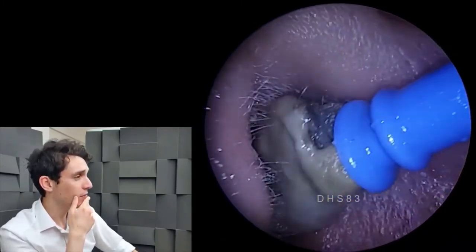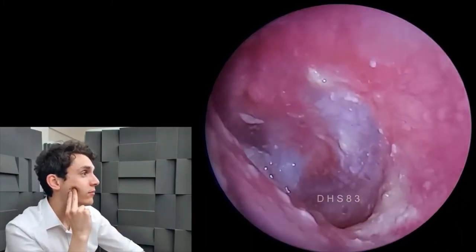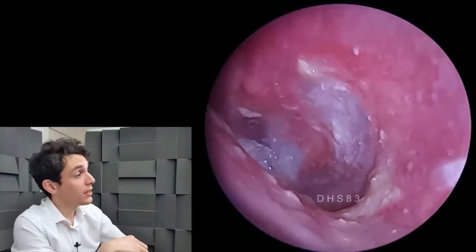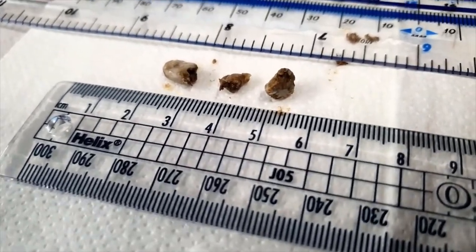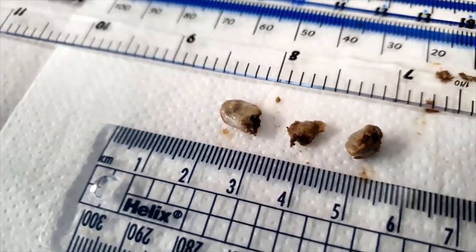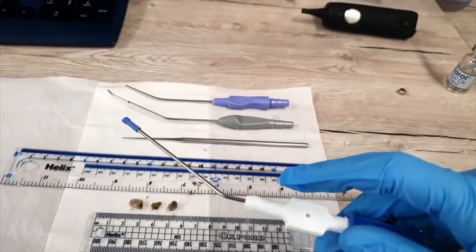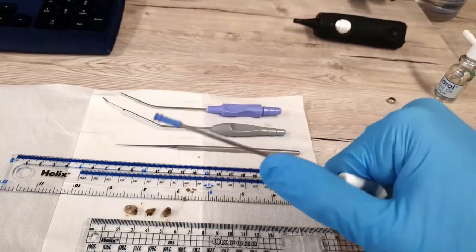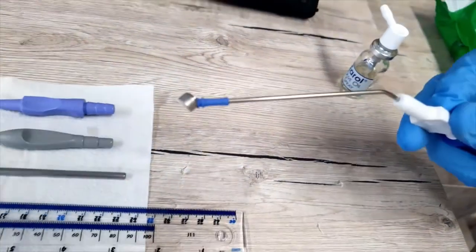A fairly effective tool to have in the arsenal. The ear canal is looking very sore — fairly inflamed eardrum — but again to be expected given the amount of pressure and abrasion during the procedure. This is the debris we've removed: good centimetre chunks, and you can see the fresher skin on the outside of the plug. This is the Clearway handle — that's the little fenestration in the handle where you cover it to increase suction power. The actual steel portion turns, which I thought was unusual and somewhat annoying, but it allowed me to orientate the hole so it was comfortable for me.